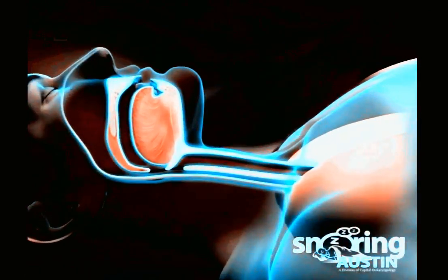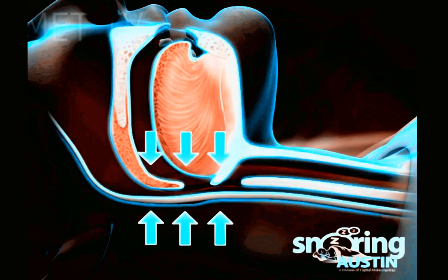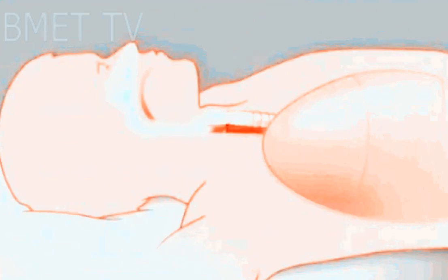Critically ill patients have severe sleep disruption and typically encounter loss of circadian sleep pattern, sleep fragmentation, increasing proportions of transitional stages of sleep, and loss of slow wave and rapid eye movement sleep. Mechanical ventilation is associated with these same sleep abnormalities. But what is attributable to the intensive care unit environment versus mechanical ventilation itself may be difficult to discern. Recent studies have shown that the ventilator mode and inappropriate settings can contribute to sleep fragmentation, and it is important to avoid overventilation that can induce central apneas when using spontaneous breathing modes.